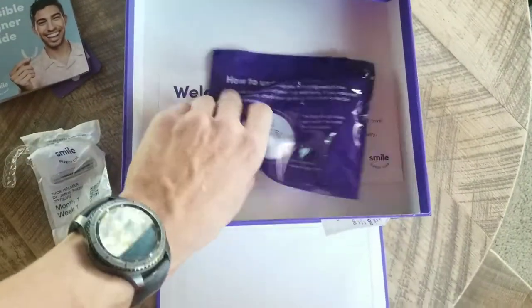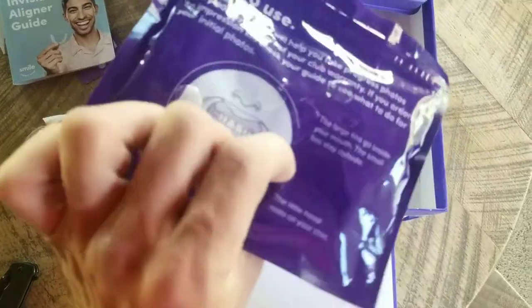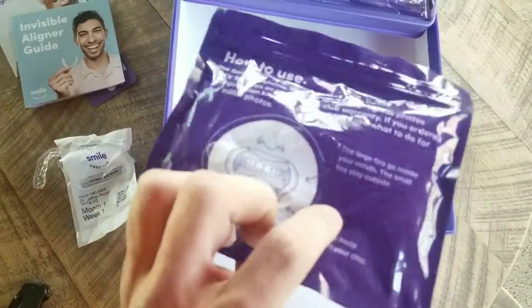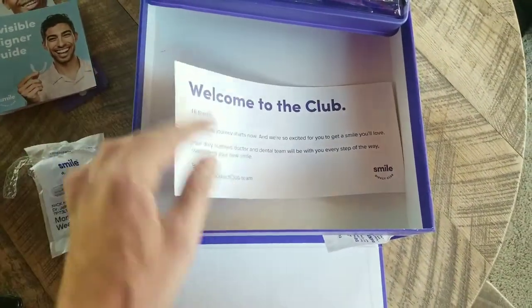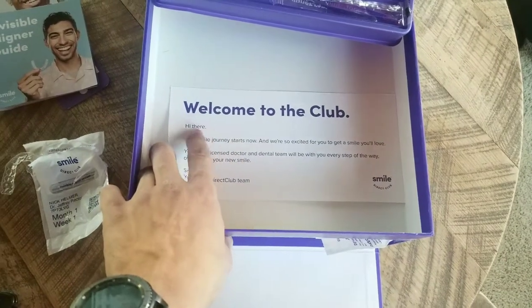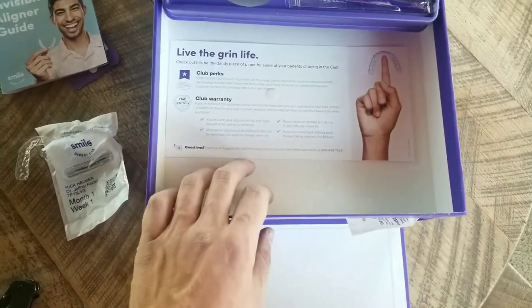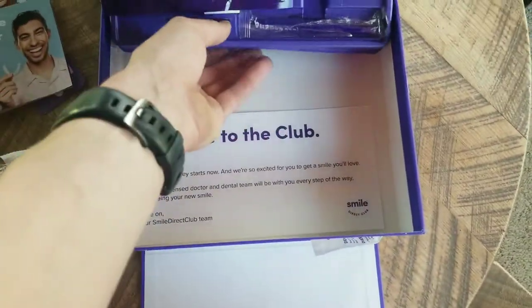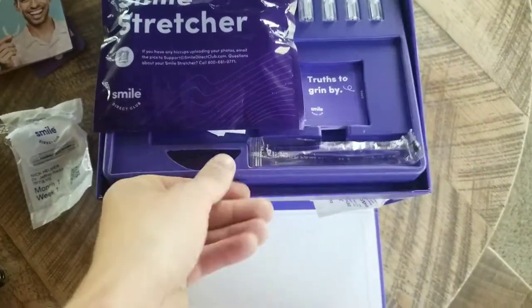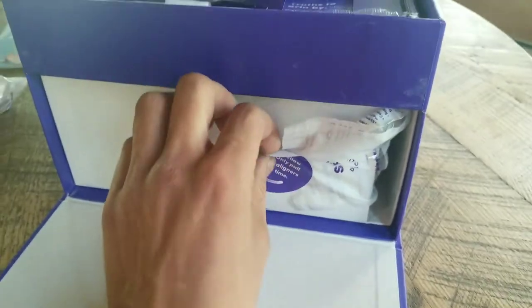Excuse me. And then at the bottom you have a smile stretcher for your checkups every 90 days, so they can see how things are coming along. And then a welcome to the club card. I was told — and from what I've seen — it shows a name, but they didn't really customize it to my name. Not really that upset about it. It gives you a little bit of the perks and warranties and so on.